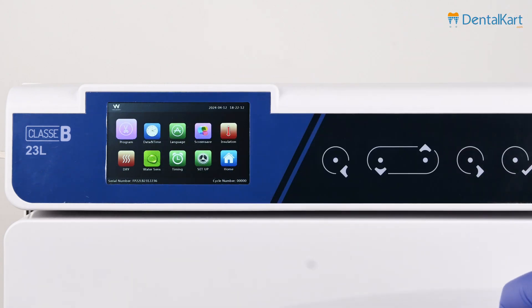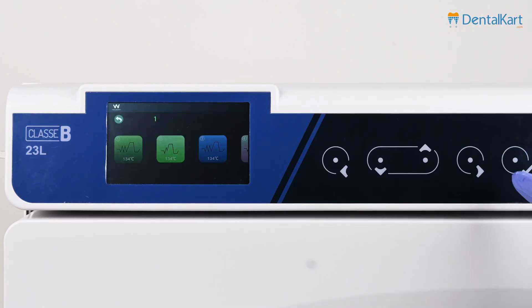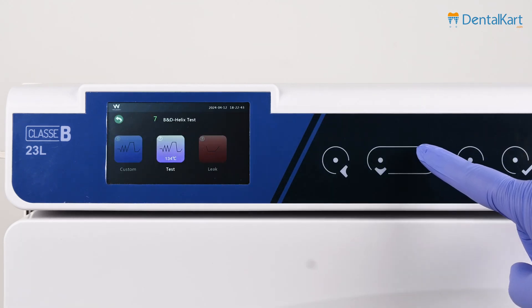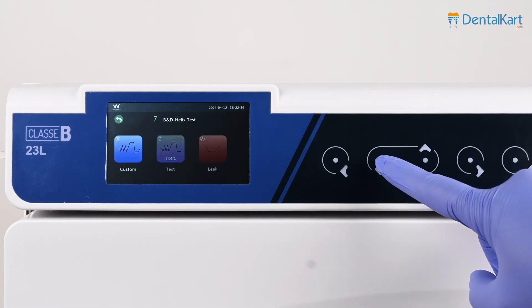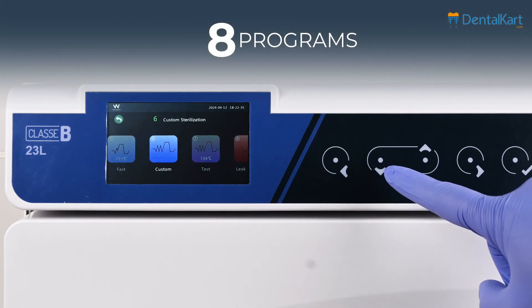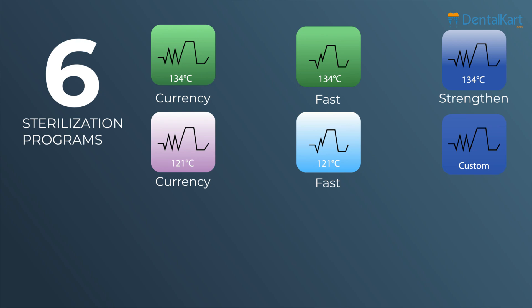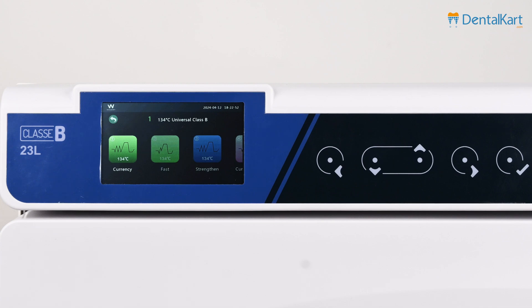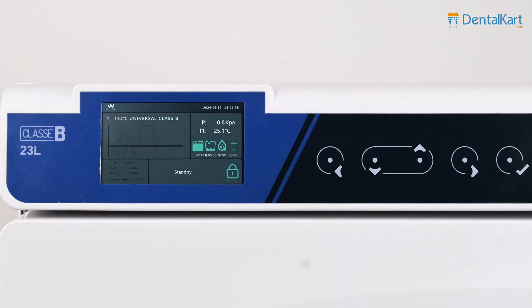Select the program icon and then press the confirm button. Different cycles will show up; press the up and down buttons to select the cycle. There are a total of 8 programs: 6 sterilization programs and 2 testing programs. Here we are using a 134°C Class B sterilization cycle. Press the confirm button to enter the cycle.